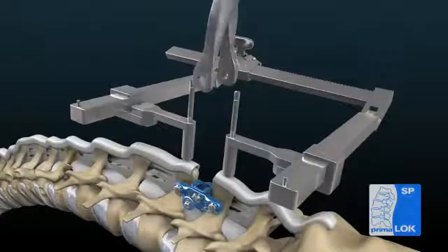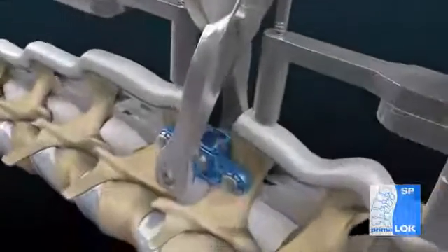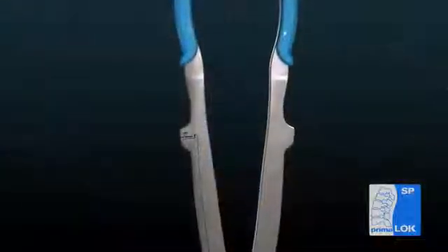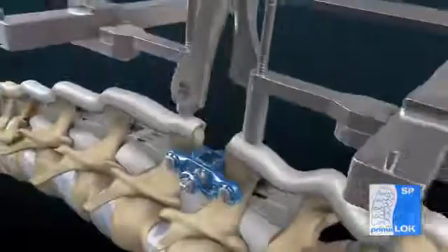Align the lock ring compressor so the circular cutout fits over the tip of the central post and the dimple seats onto the base of the post on the opposite side of the implant. Squeeze the locking tool until an audible click is heard, indicating that the final locking compressive force on the lock ring has been achieved.